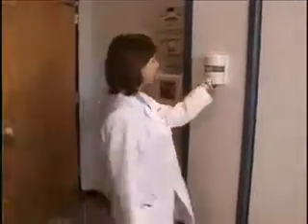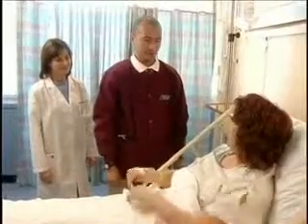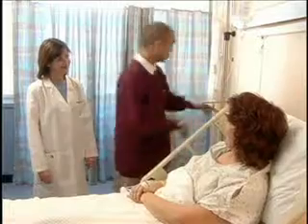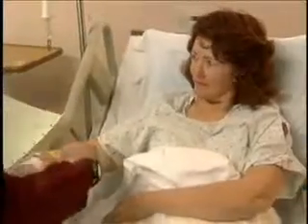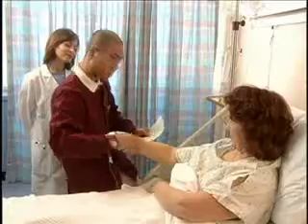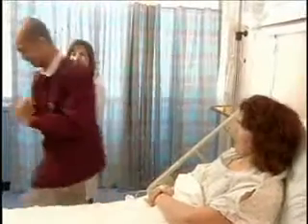Hello. Good afternoon, Mrs. Parker. How are you feeling? I'm doing quite well, thank you. Oh, good. I'm here with my instructor, Miss Swenson, to administer an antibiotic. Is that okay? That sounds fine. I have no problem with that. Good. Let me take a look at your ID band. Okay. And tell me your name. Sylvia Parker. Good. I'll just clean my hands.